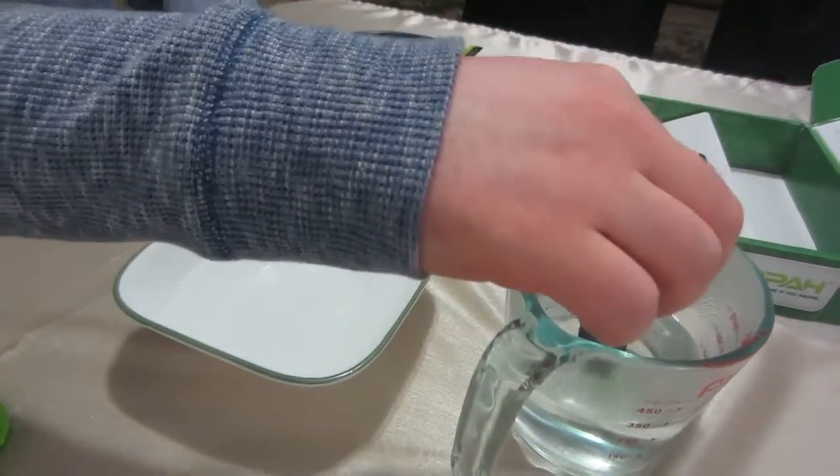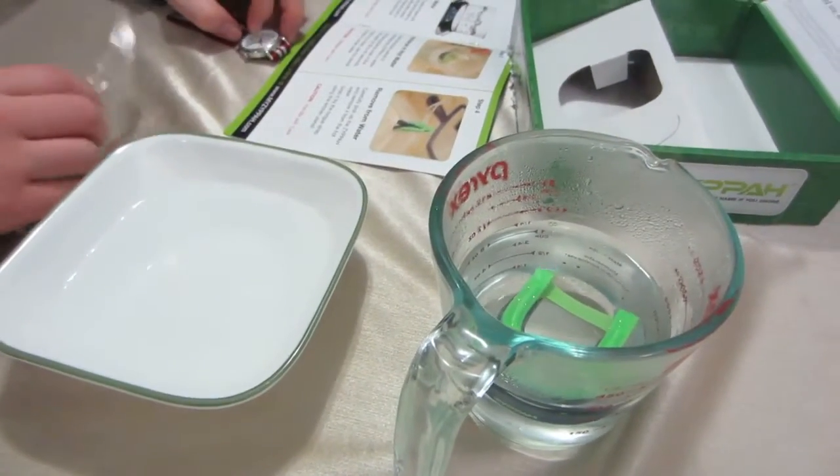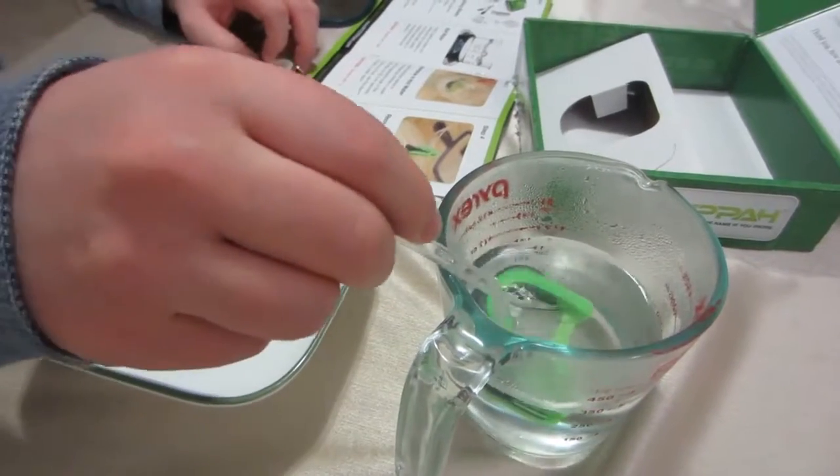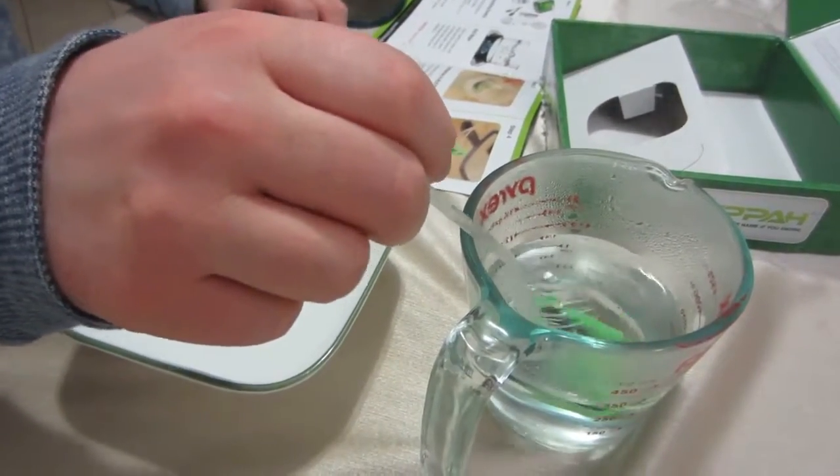So without further ado, drop it right in and we're going to wait 30 seconds. It tends to float to the top so we're going to push it down. It's going to get nice and soft and we're going to create a nice mold.